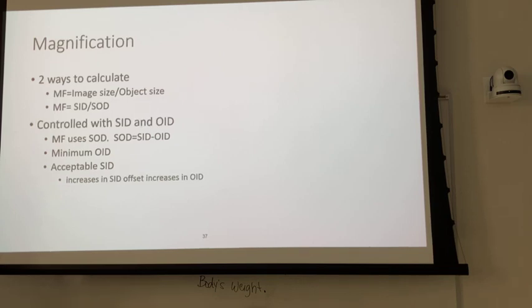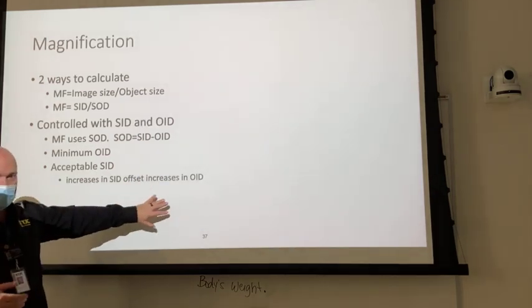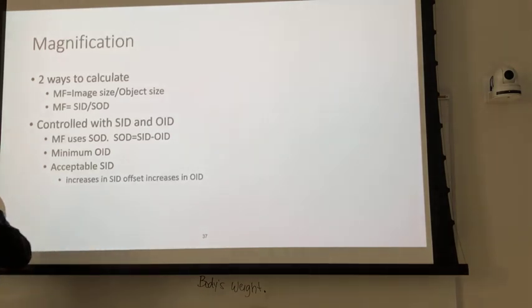So if you have magnification factor, again, there is nothing that you're going to be putting directly onto the image receptor. I used a hand before, right? Your hand, you can't put the bones directly on the image receptor, so you're going to have magnification of those fingers and of the hand and wrist bones. It's going to be there. It's going to be minute.